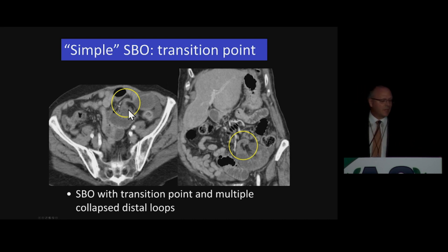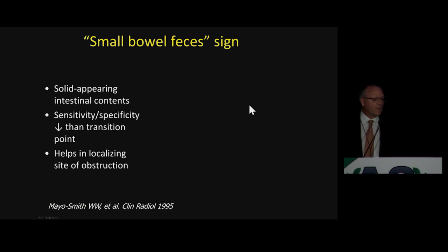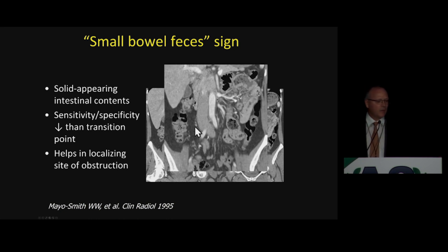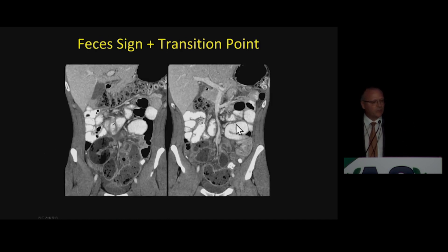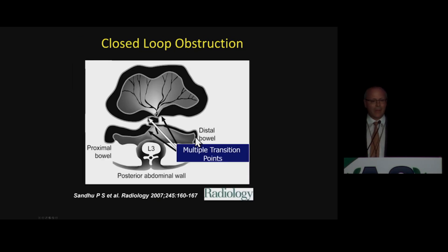Translating that to CT images in axial and coronal planes: again, a point of transition, proximal dilatation with fluid, distal collapse shown very nicely on both axial and coronal planes. The small bowel feces sign can be seen, but it's not as helpful as the transition point. It represents solid-appearing intestinal contents typically found just proximal to the point of transition, helping to localize that potential transition point. We see the small bowel feces sign, and exactly distal to the more formed content in the small bowel, that's where the transition point is located.